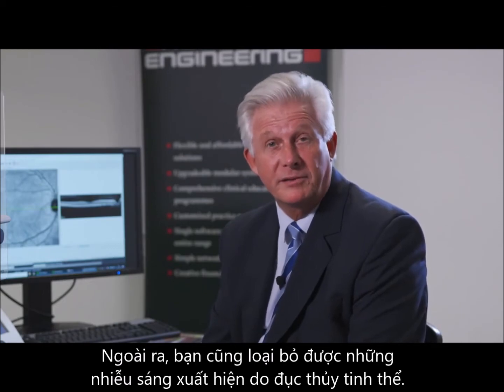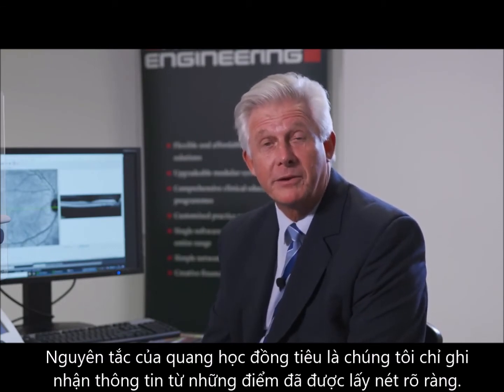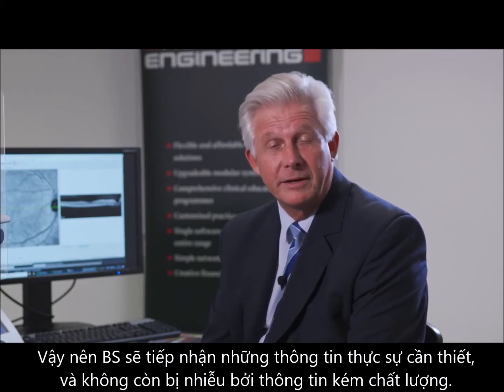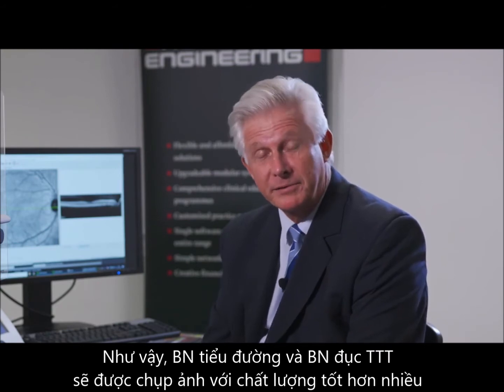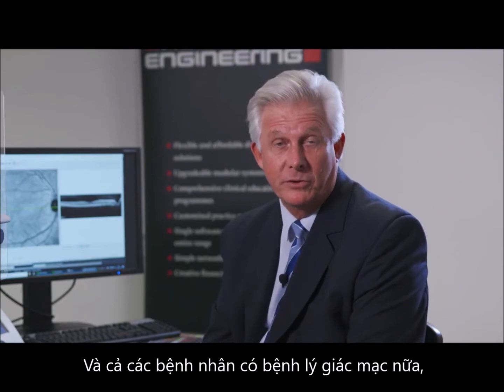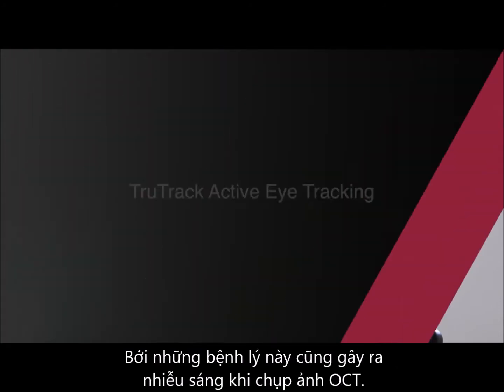Also, you avoid scattered light from cataract. The confocal principle means that we only take the information from the point of focus, so you're only capturing the information that you need, and you don't use the unwanted light that's scattered by the cataract. So you're much better for diabetic patients, and you're much better for cataract patients, and also any patient with a corneal condition, because that also has the effect of scattering the light.